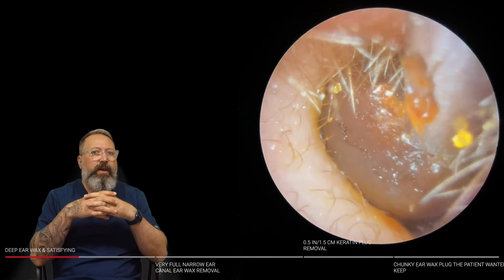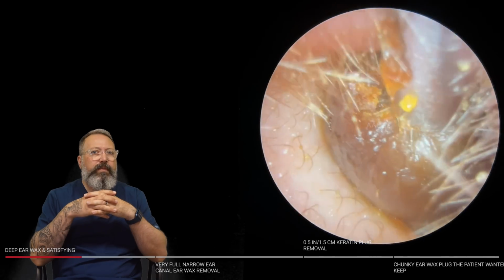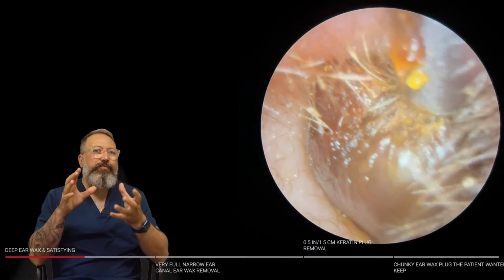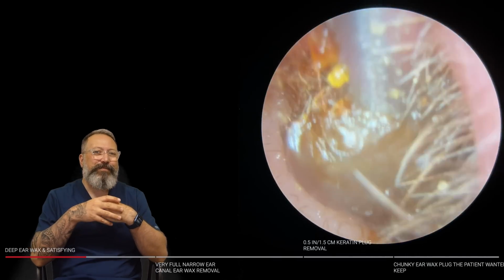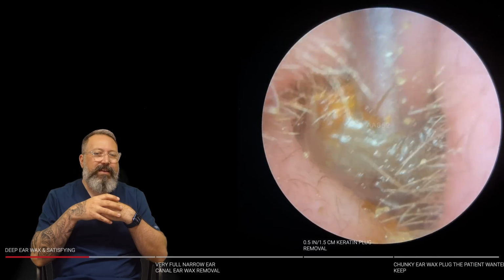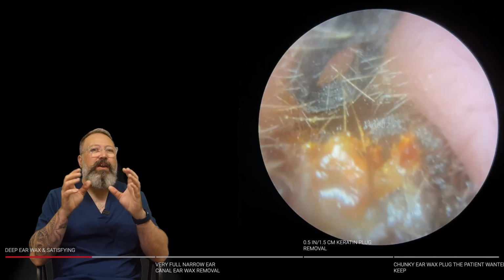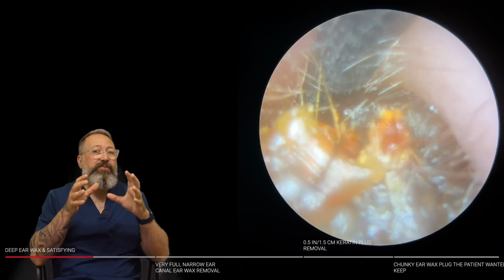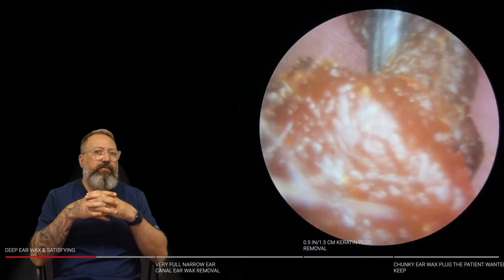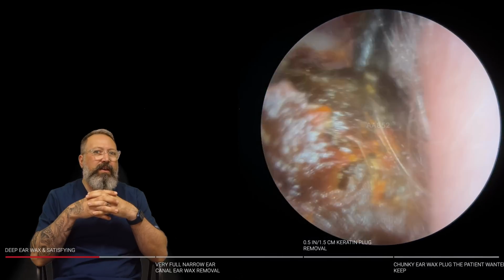It's on its way. Nearly. A bit more of a wiggle. We've got to kind of bend it or maneuver around those two bends in the ear canal now. So we're just kind of lifting this bottom section. It's nearly there. A bit more of a wiggle. Oh, it's a little bit softer. As I was trying to wiggle it then, it was just moving the surface of the wax. So we've opted to go in with the Jobson horn here. Let's just pull this out the remainder of the way. You can see it kind of unfolds as we pull it along there.